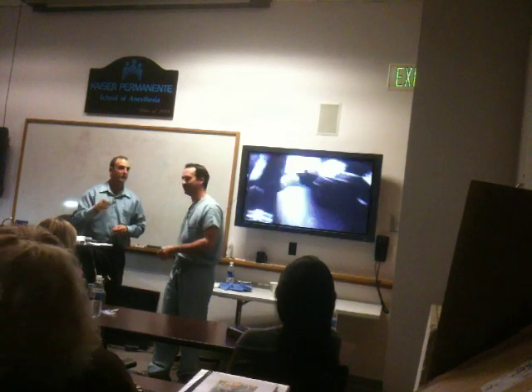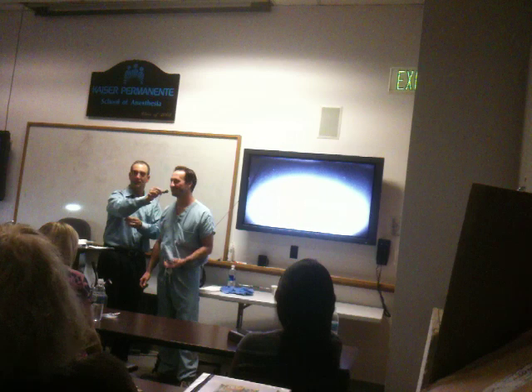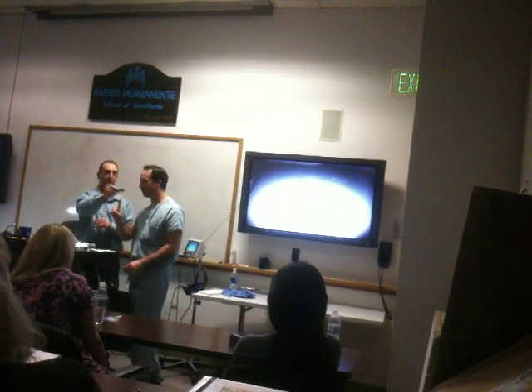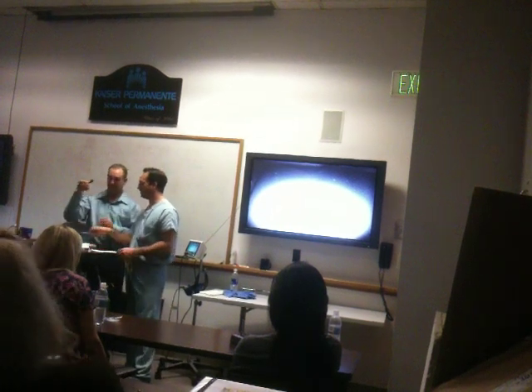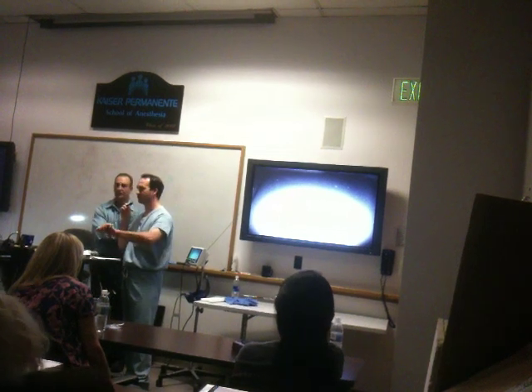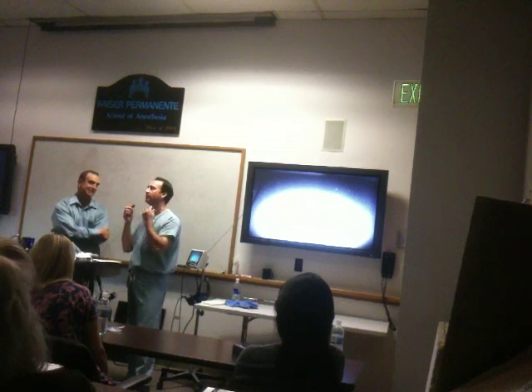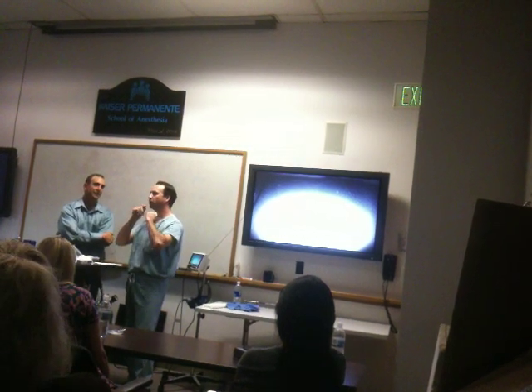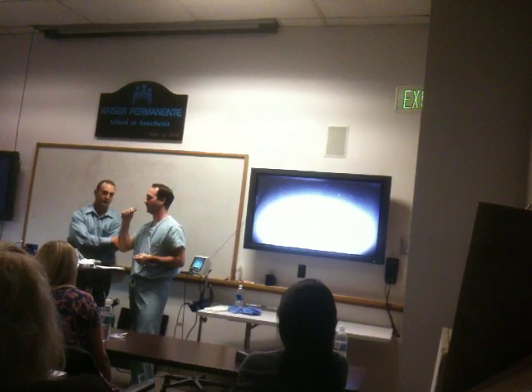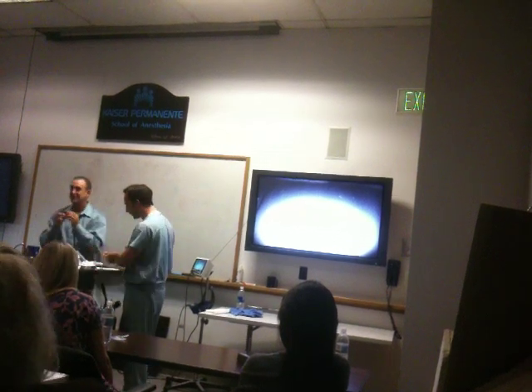I showed you guys already. Can you tell my voice is changing now? With a DL — direct laryngoscopy. So I'm going to do one more thing. I'm going to take some right-angle forceps, dip them in some 4% lidocaine, and try to get the superior laryngeal nerve. It runs right above your vocal cords, right in the back of your throat on the anterior wall. Then I'm going to try to drip a little bit of lidocaine onto my cords. I might cough — and if I cough, that's good.